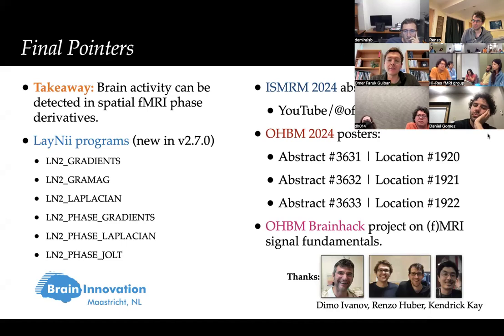Like you need to unwrap it, you need to brain mask it, you need background field removal, and all these steps. I don't agree with some of them, even from a problem point of view: why are you forcing the circular measurement that is phase to be a real number? I mean, that's coming from minus infinity to plus infinity. It's a circular measurement. You need to treat it as such. You cannot just force regularity into it. Indeed, it doesn't work. There will be singularities and so forth.